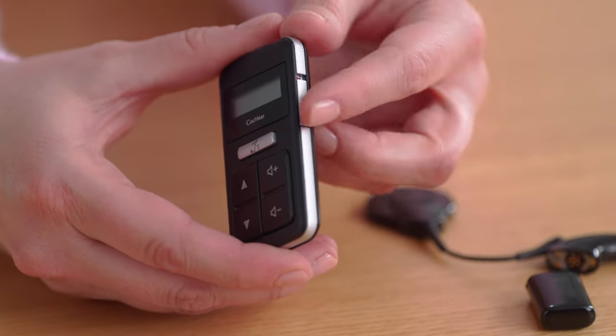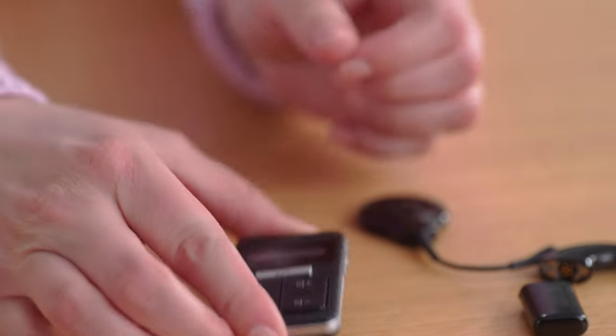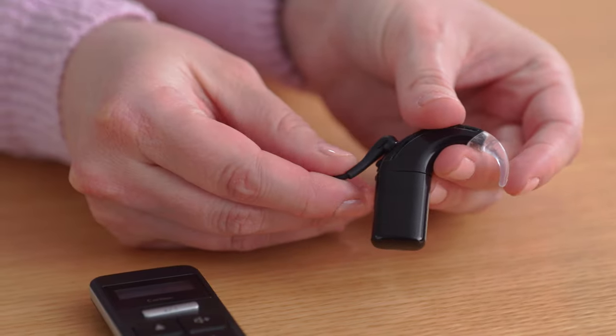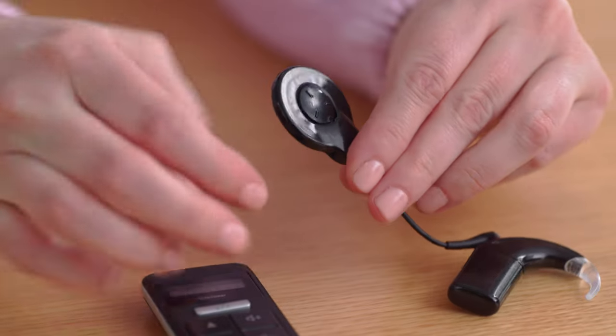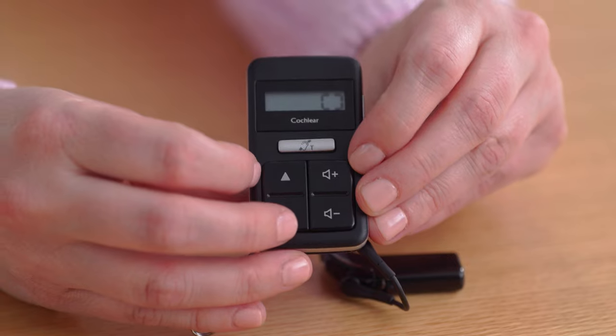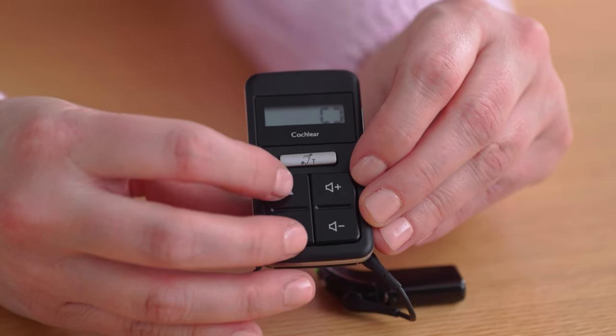Ensure both the remote control and your processor are turned on. Take the Nucleus 8 coil and touch it on the back of the remote control. You'll see an icon on the screen indicating pairing was successful.